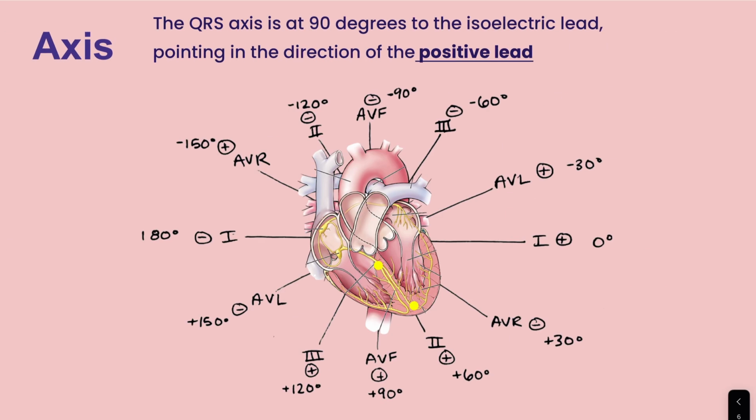All right, so let's put this to a picture that hopefully you understand as well, and that's the heart. If we think about the flow of electrical current from the heart, like I said, we go from this right corner and we go down through the ventricles and out, right? The bulk of the flow should be going down towards the apex. That is how we are designed. And so it makes sense that normal would be anything from this positive 90 to this negative 30.